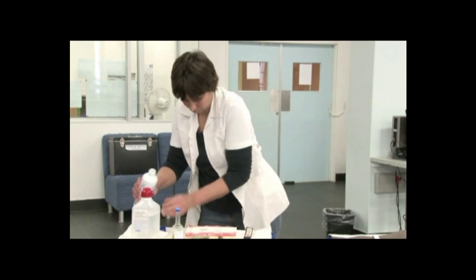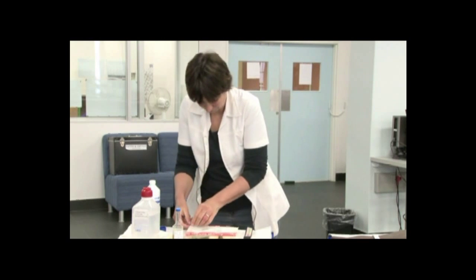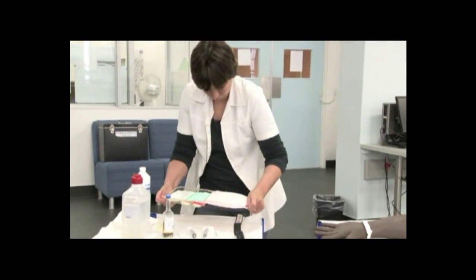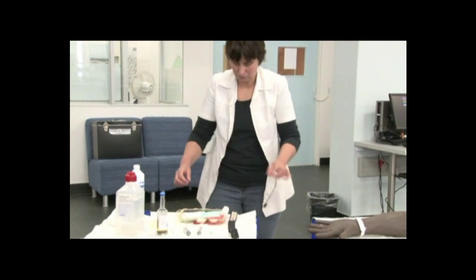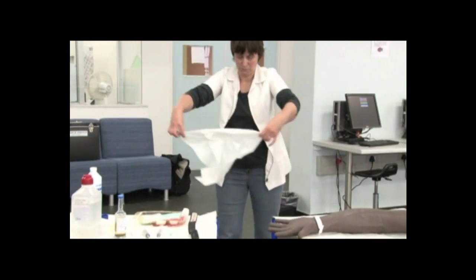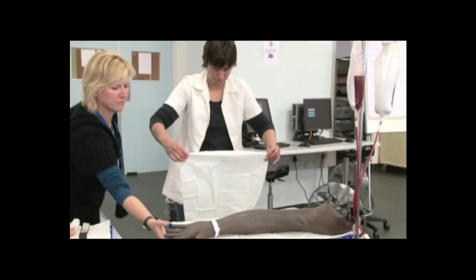Open the sterile blood culture pack onto the trolley once you have done this. Remove the sterile sheet, touching only the exposed corners, and place this under the patient's arm. Ask the patient to move his own arm, otherwise find someone to help move the patient's arm if he is unable to do so himself.